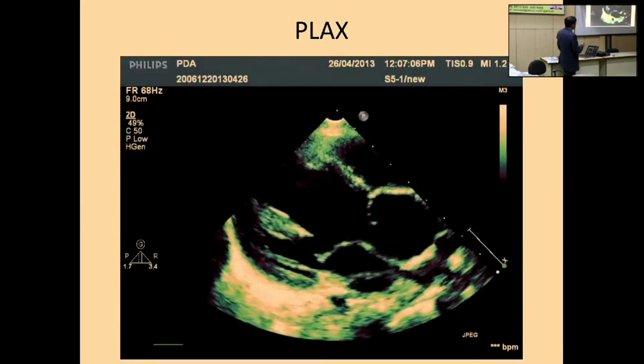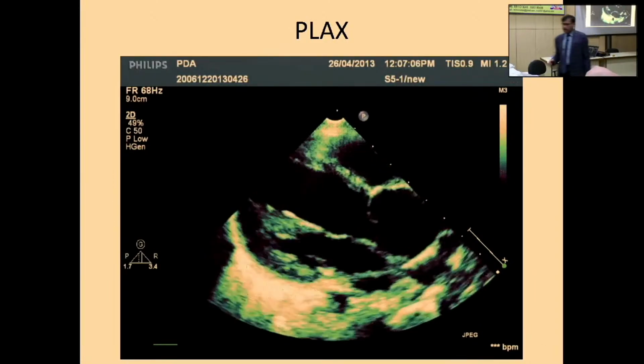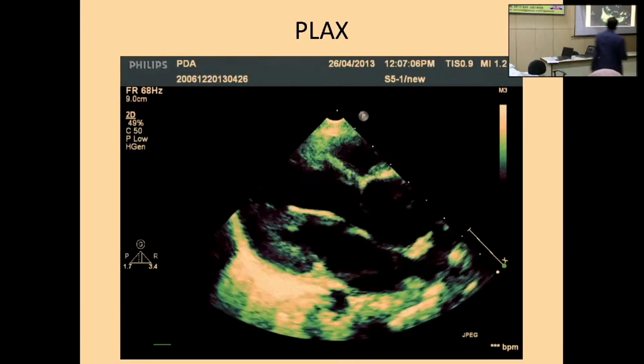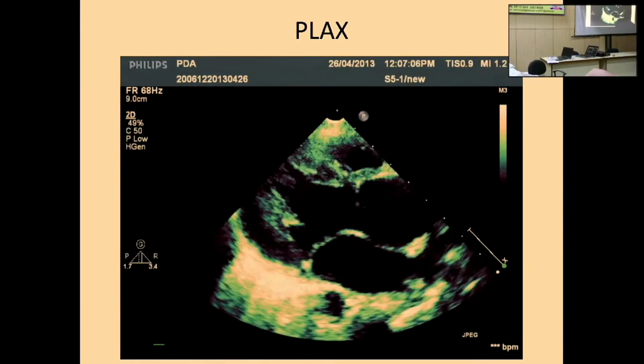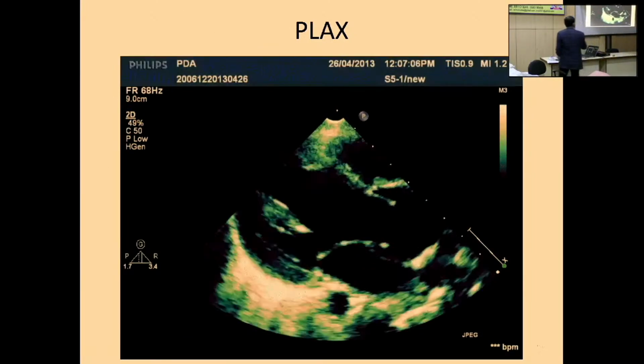Again, in this view, I am seeing the LV dilatation. If you take the Z scores, I don't know where the pointer is. This pointer doesn't work in between. So this is the LV dilatation, and this is applicable to VSD and PDA both.